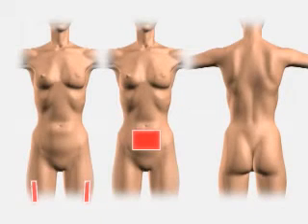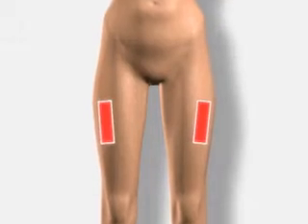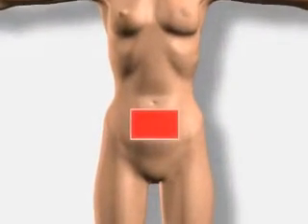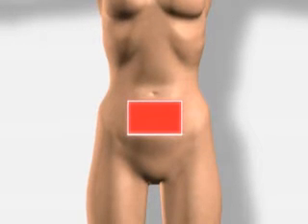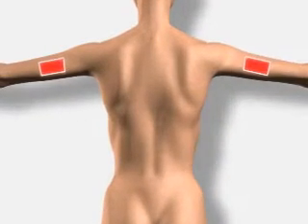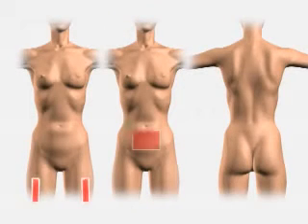Now you need to determine the subcutaneous injection site. These sites include the upper outer portion of your thighs, your abdomen — staying approximately 2 inches to the right, left, or below your belly button — and the outer aspect of upper arms, approximately 2 to 3 inches from your shoulder. Rotate your sites daily.